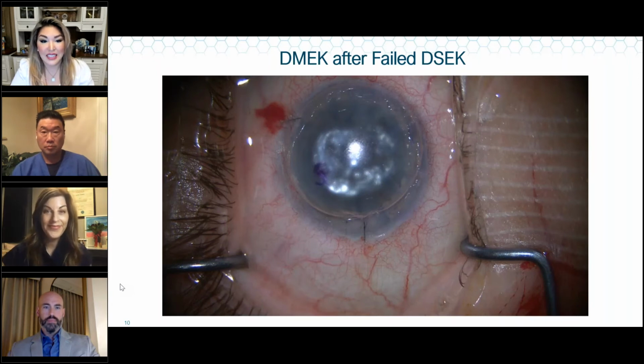And we don't either. We just do it. Yeah, we just have them sit up, and you can visually see that you'll have a meniscus from the bubble. We want to make sure it's covering the PI.